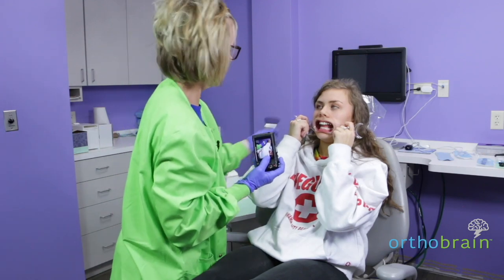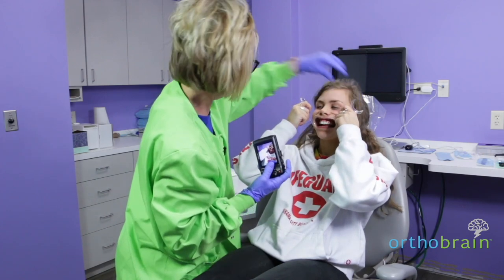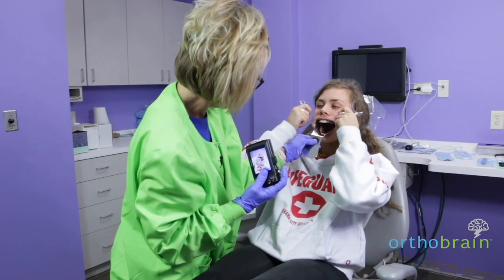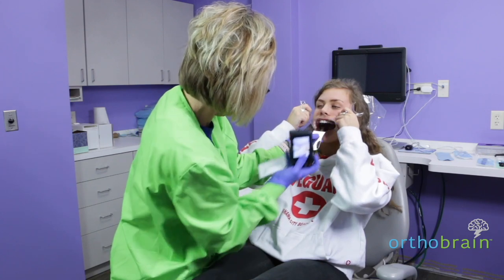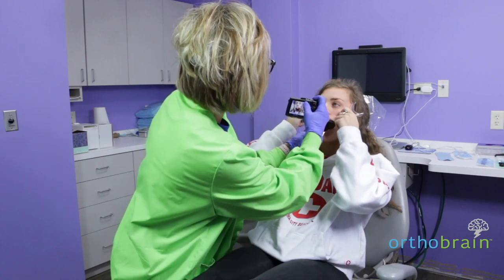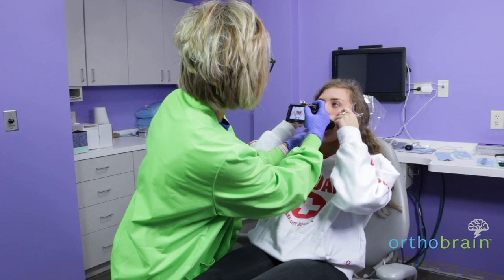I want you to take the cheek retractors and angle them up towards the corner of your eyes like that. I'm going to place the mirror in your mouth and hold it so that you can see the molars — the very last molar. Tip your head back for me just a little bit. Focus on the teeth and then move the camera down just a little bit.